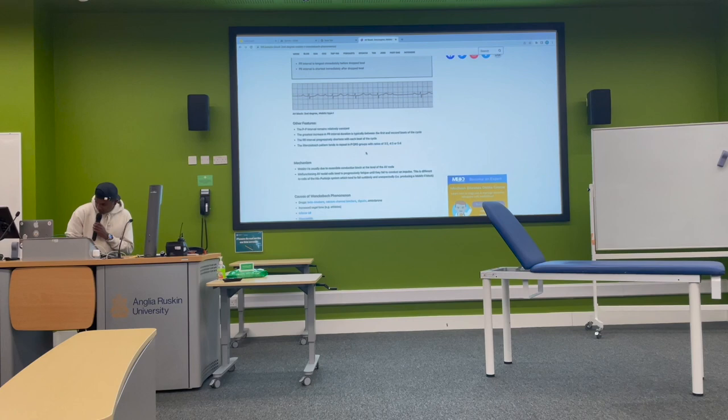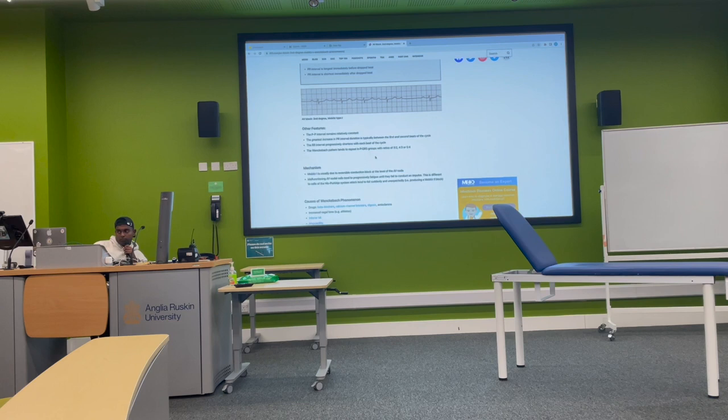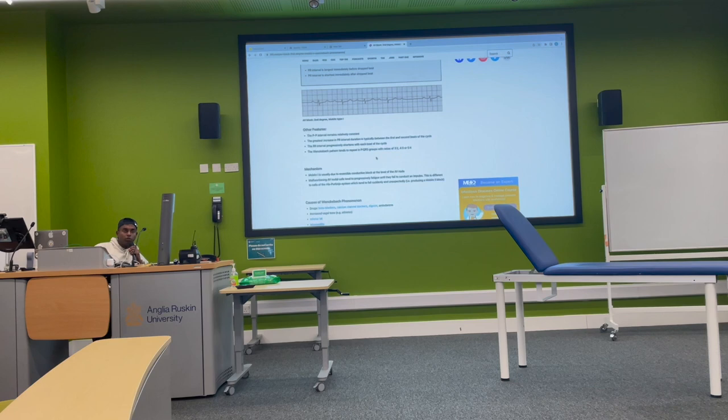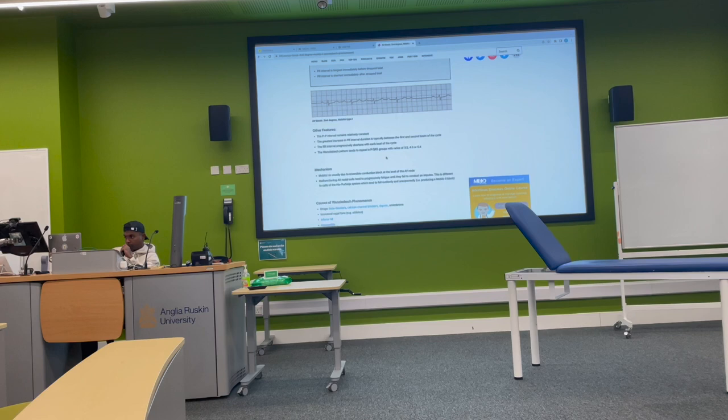Okay, so, mechanism of action. What does ECG represent again? The electrical impulses within the heart. Right. So if I'm talking about the mechanism of a second degree Mobitz 1 heart block, what am I referring to? Wenckebach? Correct. But what mechanism? I'm not asking you to explain the mechanism. What is wrong, basically? Something in the conduction. Yeah. If it's an AV block, it's a conduction block at the level of the AV node, but you need to remember it's reversible.